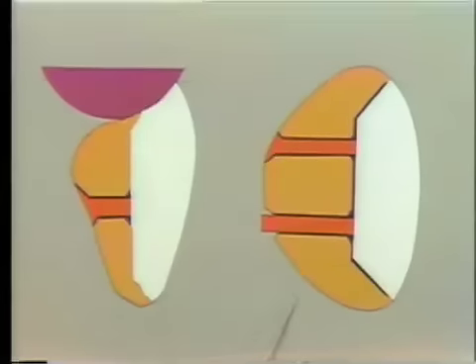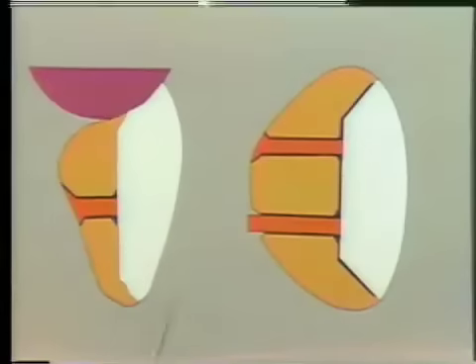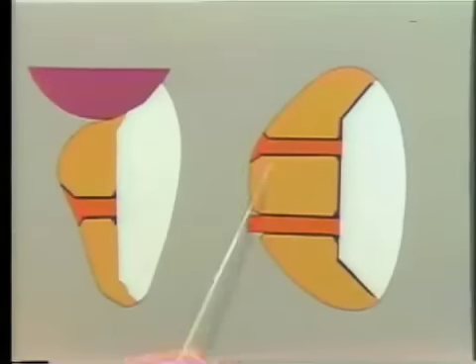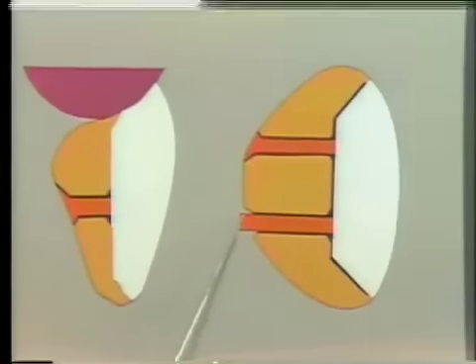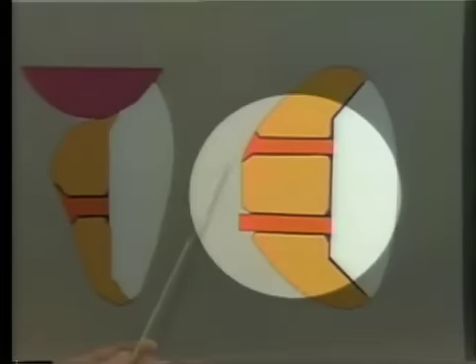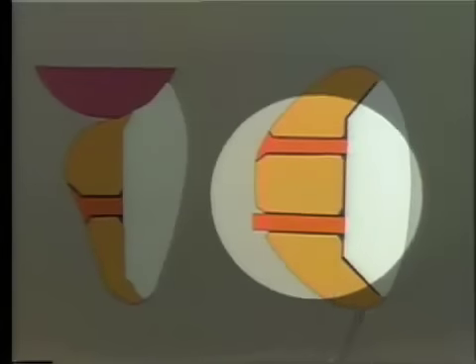This other diagram here is a cross-section through this at this sort of level here, so that you see the two pins here. This one has gone through, has not yet been ground off to fit into the bevels on either side here. This one has been adapted. This slide in particular shows the nature of the interproximal finish of the gold.